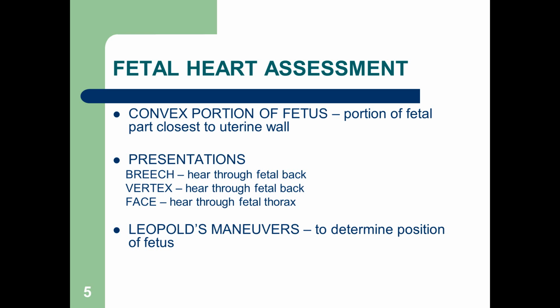Usually it's the convex portion of the fetus that's closest to the wall of the uterus, and so that's where you can hear the best fetal heart tones, okay? There are presentations, and again, I'm not going to put any pictures on there for you all to determine if it's LOP or such, but with breech, you can hear the fetal heart tones through the fetal back.